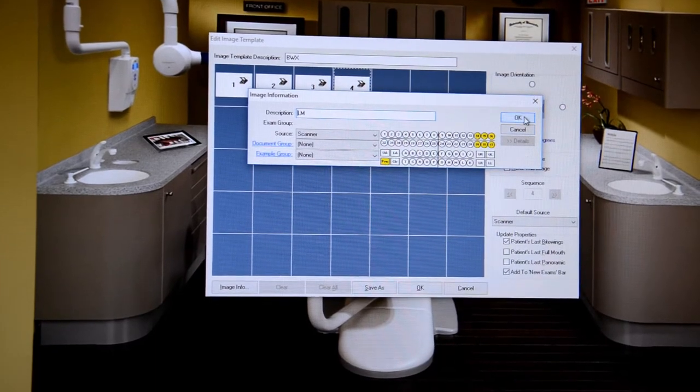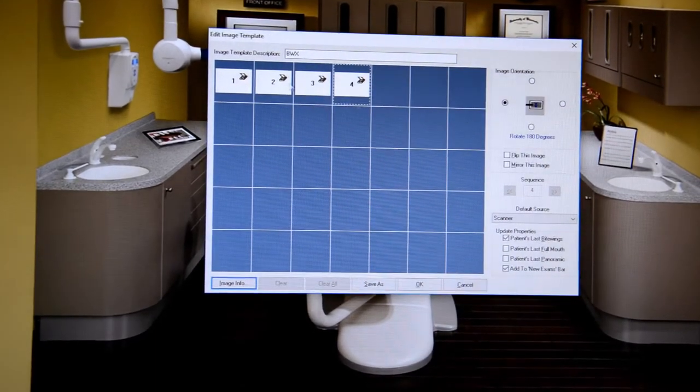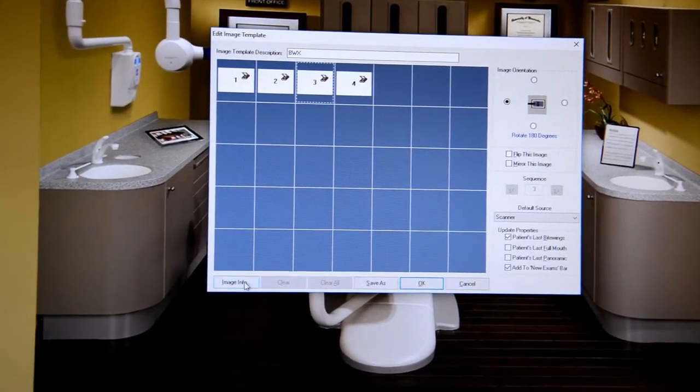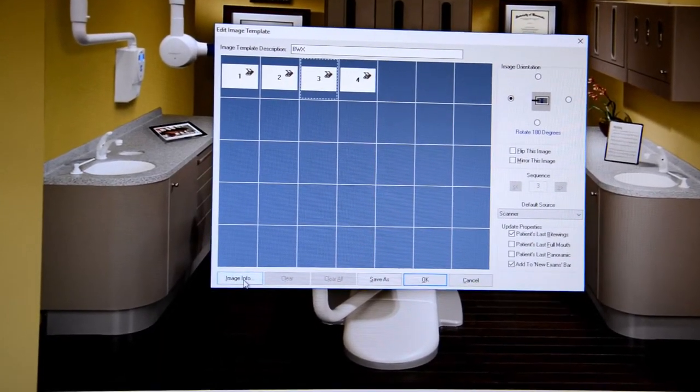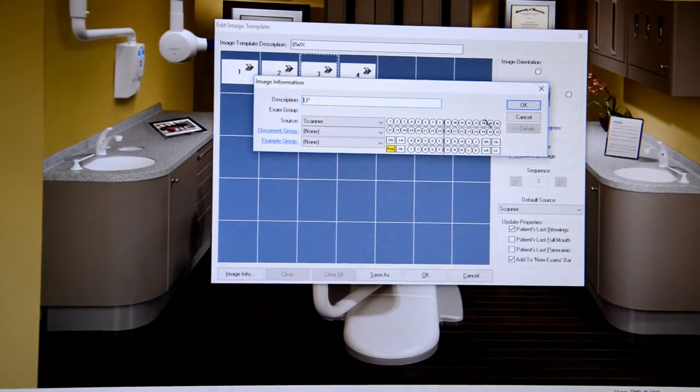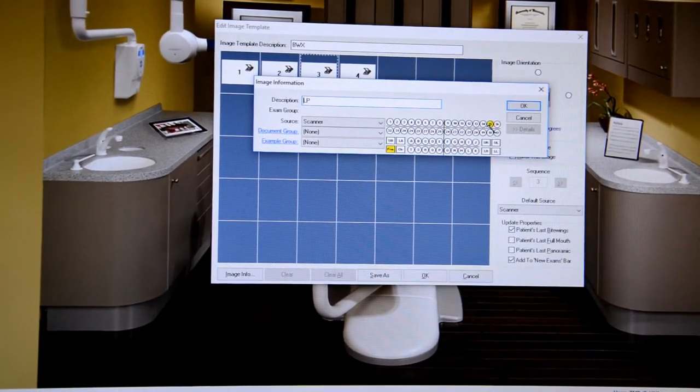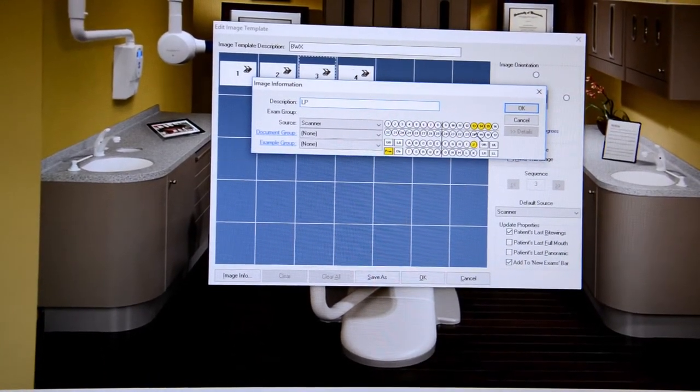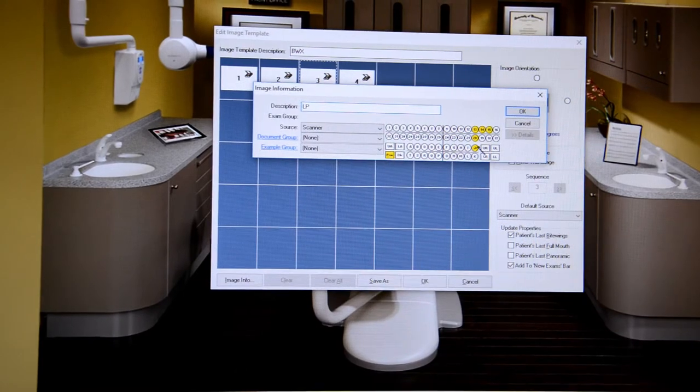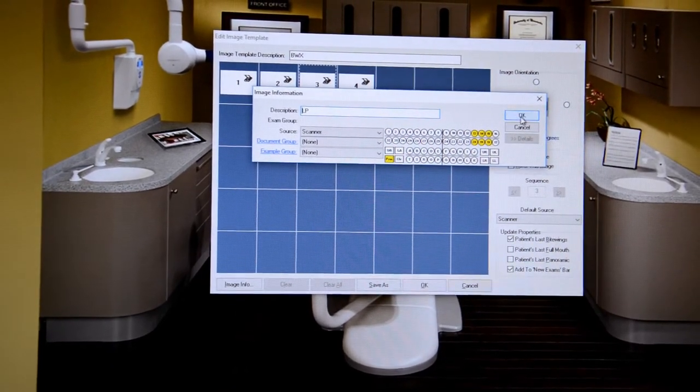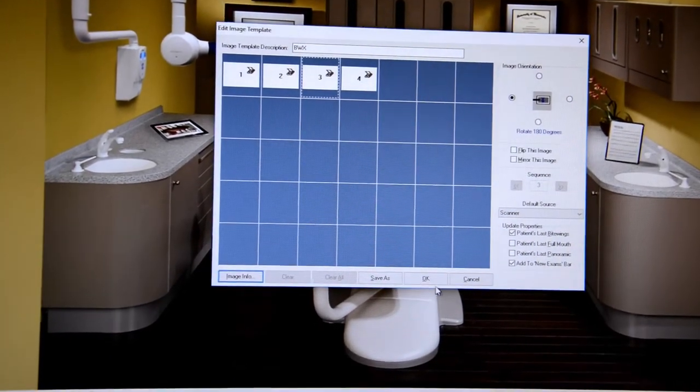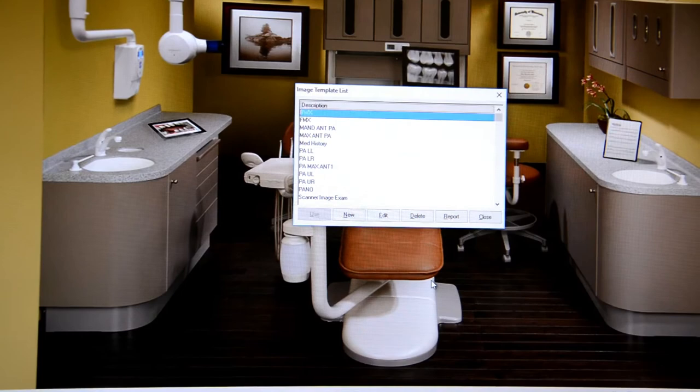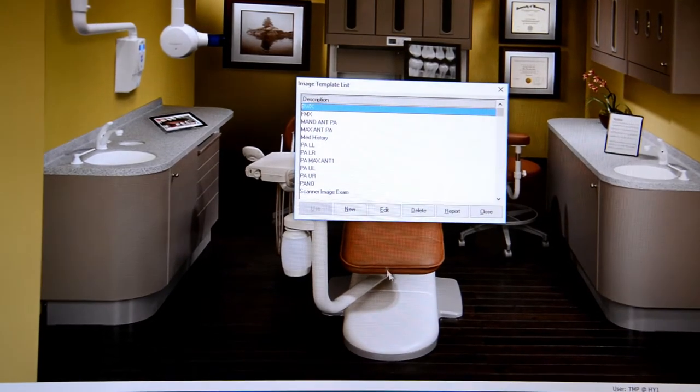What this is going to allow for you to do is to be able to sort your images specifically by tooth number and make sure that they are labeled correctly in the series. Just click OK and you're off to the races.